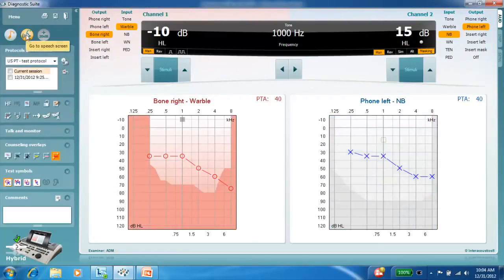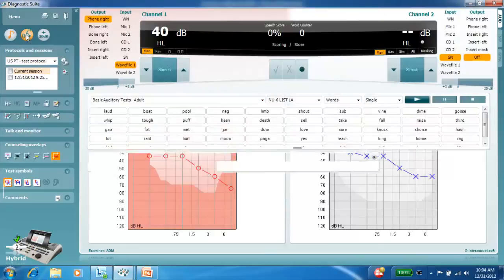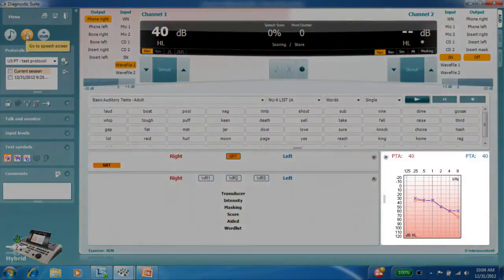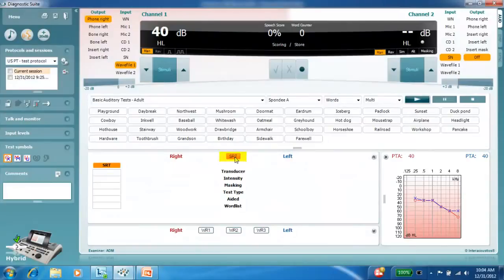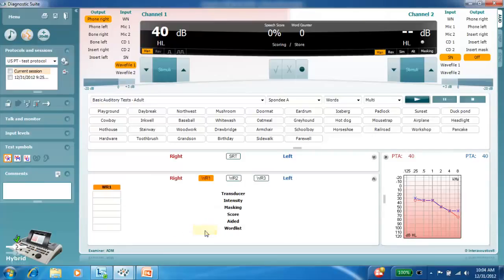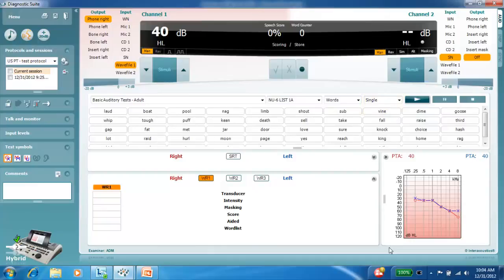Moving to the speech screen, the layout is similar to the Equinox and Affinity Suite, where the audiogram is displayed along with the pure tone average. The speech tests are accessed through clicking on the test name and then selecting the audio selection to be used when using the WAV files. You can also use mic or CD in the speech screen selection.